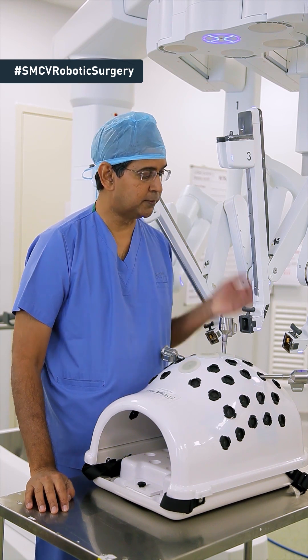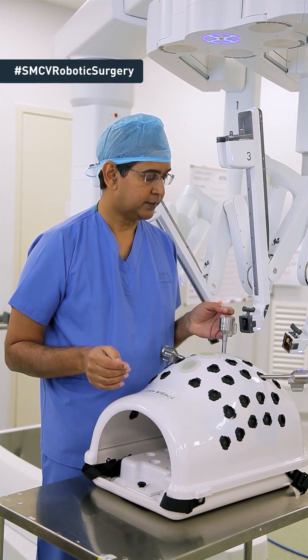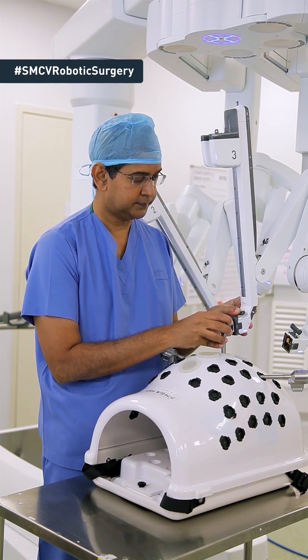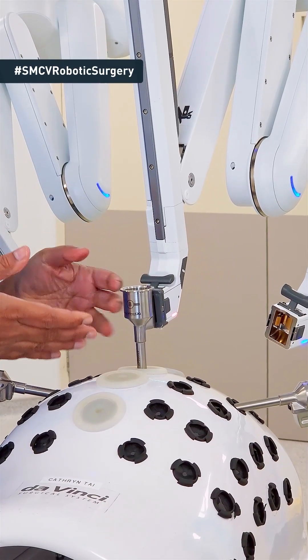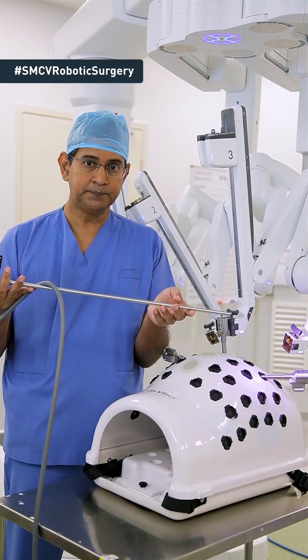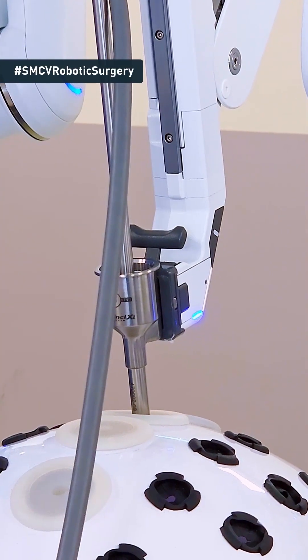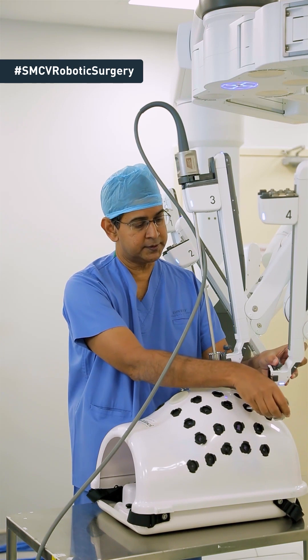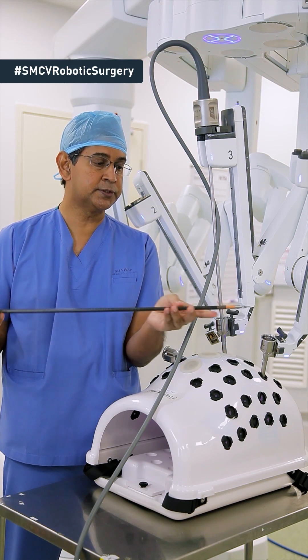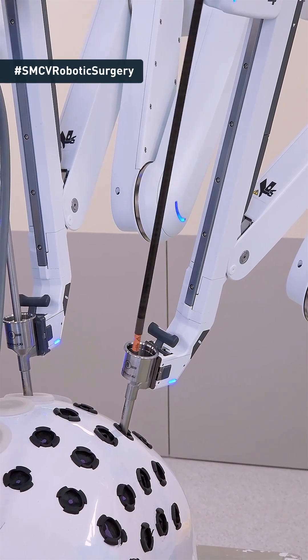I'm now going to show you how the robotic arms will be connected to the port to enable the surgery to be done. This is the robotic arm and we're moving it closer to the port — this is how it gets connected. I then take the telescope and insert it into the robotic arm like this. Similarly, we attach the other arms to the port in this manner and then introduce the rest of the instruments into the respective arms.